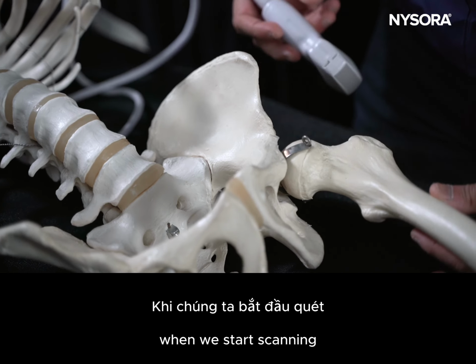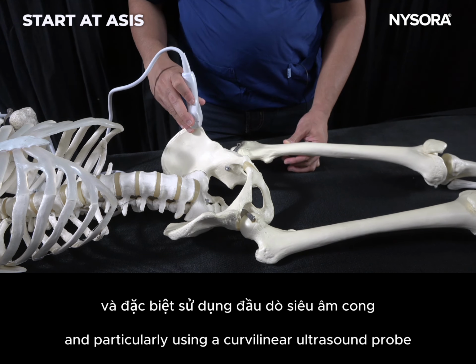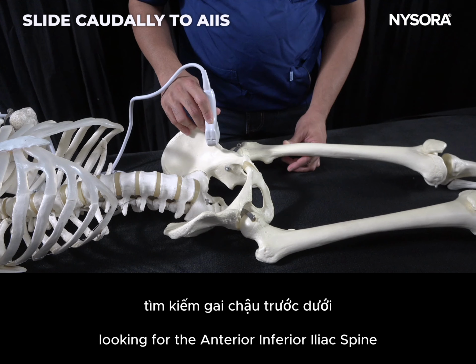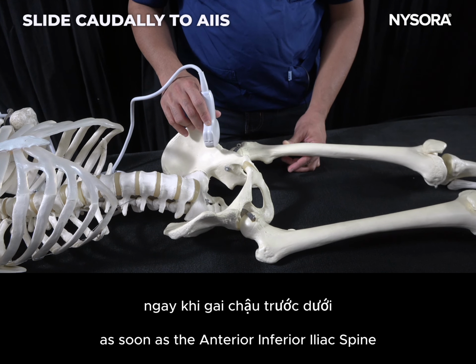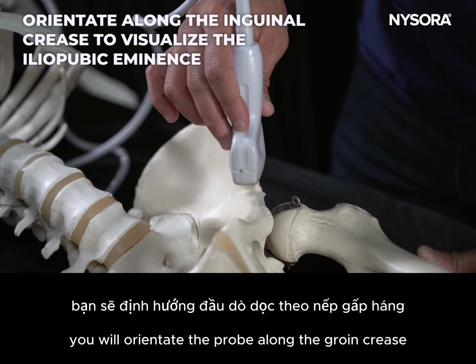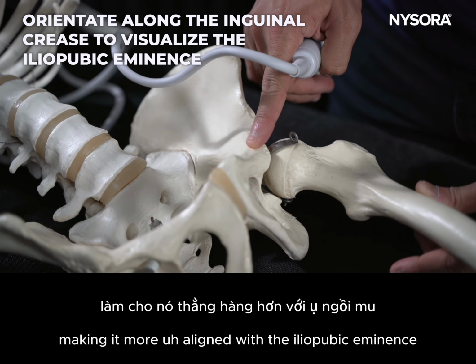When we start scanning, we will scan with the ultrasound probe, particularly using a curvilinear ultrasound probe, putting it on the anterior superior iliac spine. Step 2 would be moving down the probe looking for the anterior inferior iliac spine. As soon as the anterior inferior iliac spine is visualized on the ultrasound image, you will orientate the probe along the groin crease, making it more aligned with the iliopubic eminence.